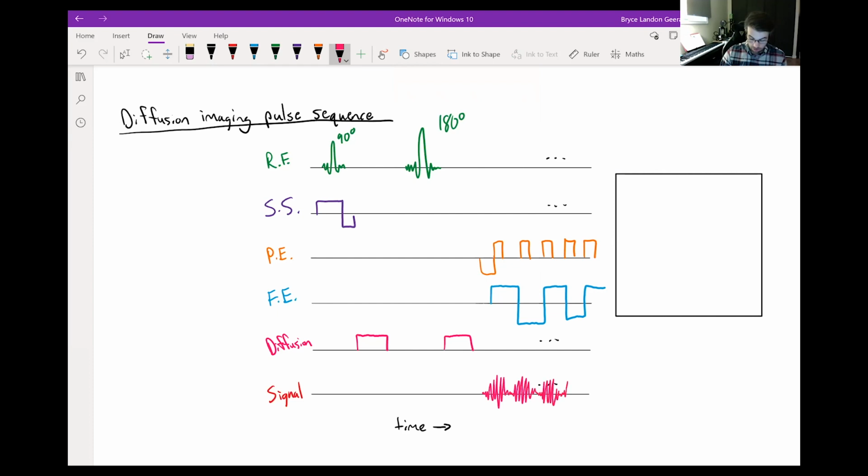I think as we've gone on with this course, my echoes have become worse and worse. But oh well. Hopefully by now you know what they actually look like, so you don't need to rely on my drawing skills. So in terms of how this looks in K-space, I guess we should have a negative phase encoding lobe or frequency encoding lobe there as well.